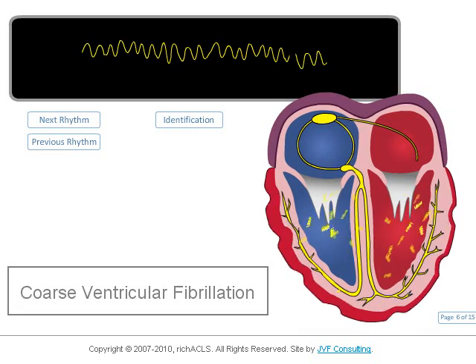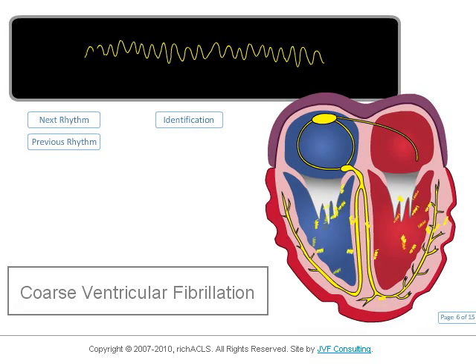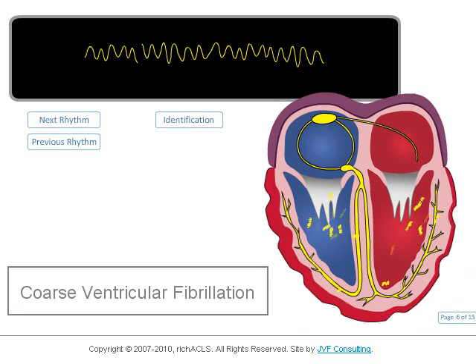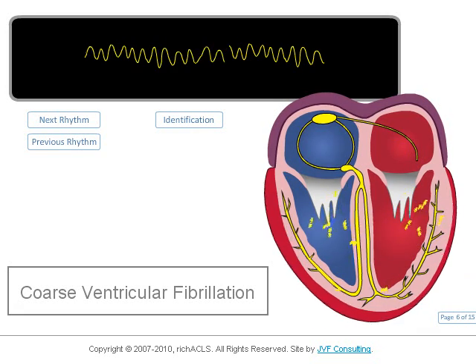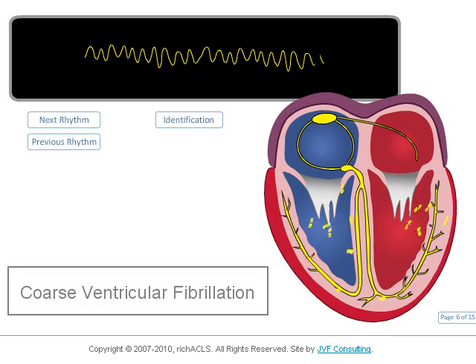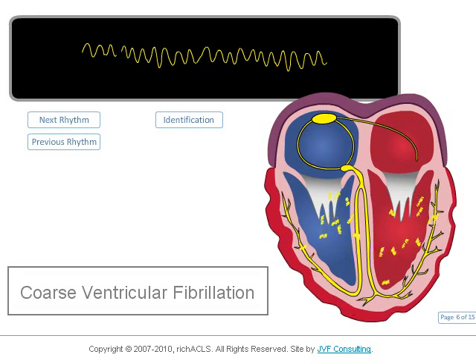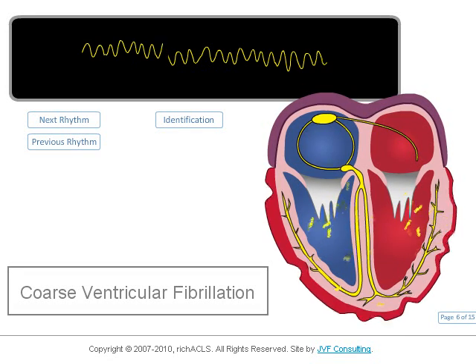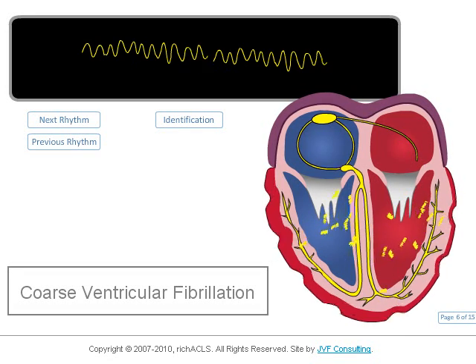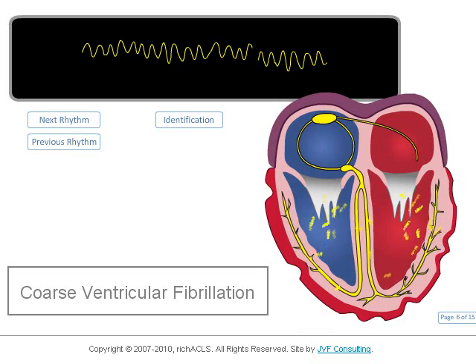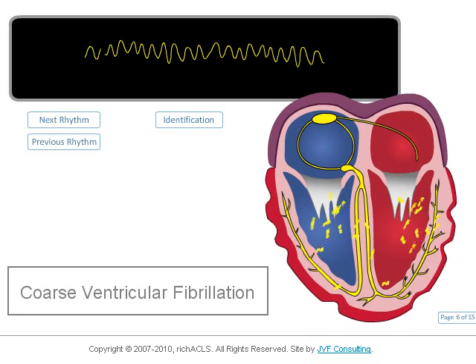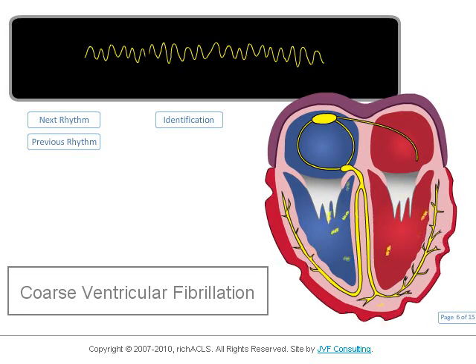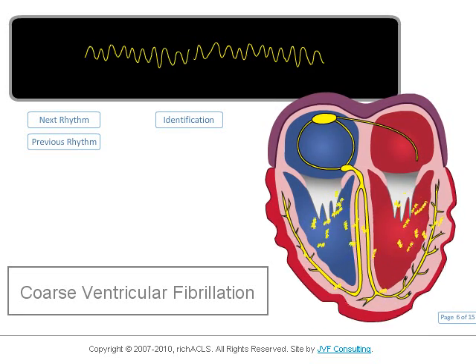Here is coarse ventricular fibrillation. Coarse ventricular fibrillation is often the result of what is called R-on-T phenomenon, where a PVC has landed on a T-wave causing this chaotic rhythm.